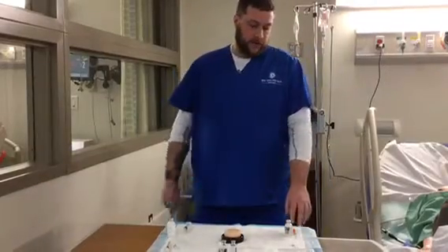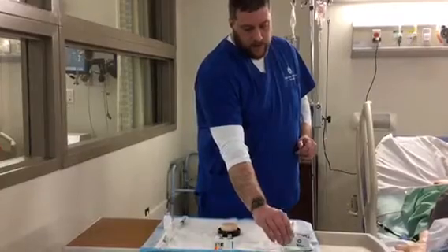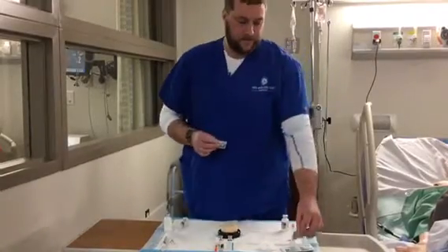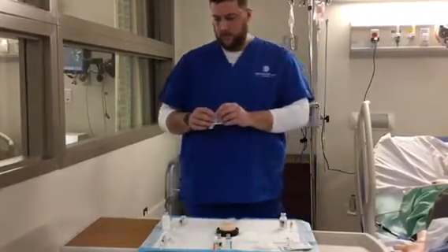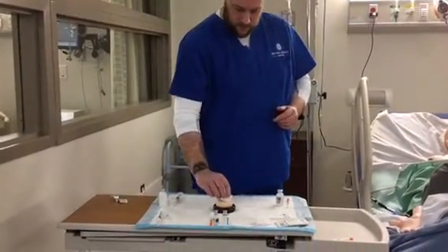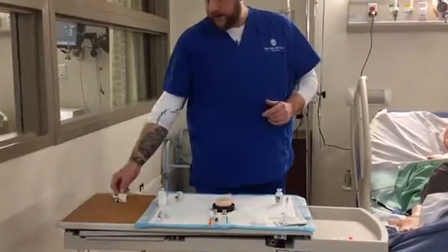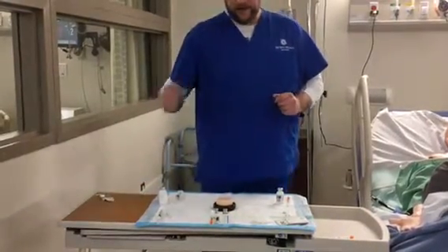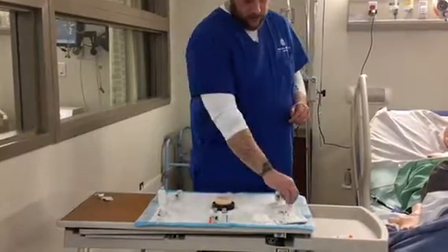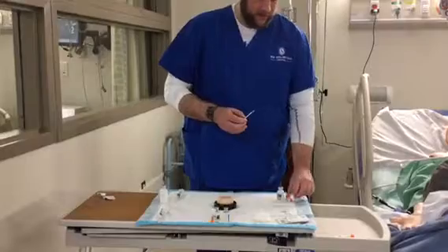Next, we're going to go on to the intradermal. For everything, you want to take an alcohol swab and clean the site. You want to allow that to dry for about 20 seconds, and once it's dry, you're good to go. So using your needle, you want to uncap it.